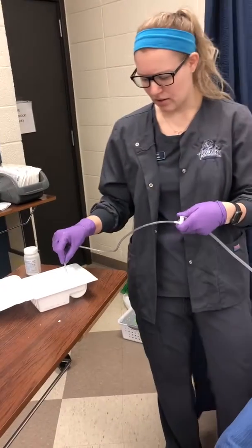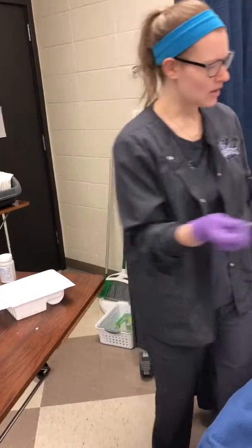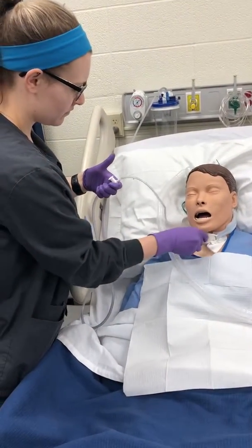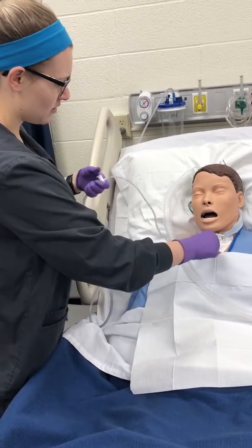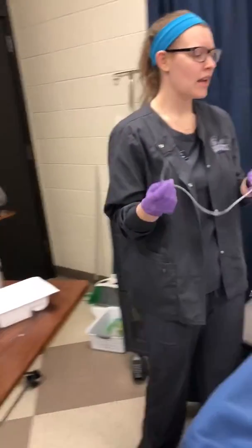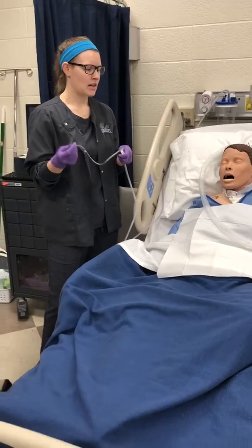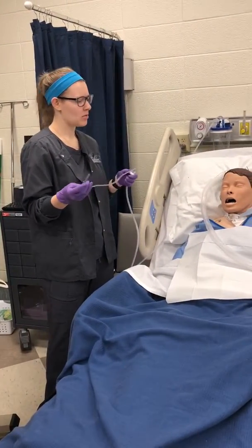And then I can suction out with the sterile water and then go again. Twist and turn and pull out. And then suction, and if I need to go again, I can. Also, before I started doing all of this, I checked his lung sounds and secretions and mucus, and we decided that suctioning was needed.